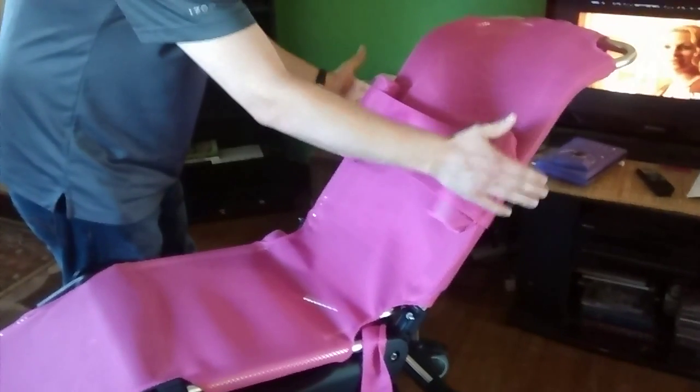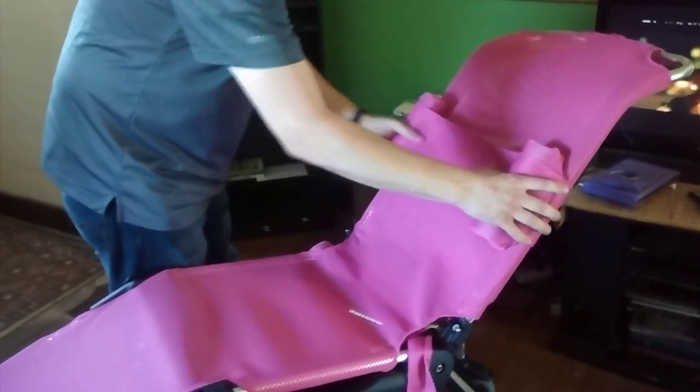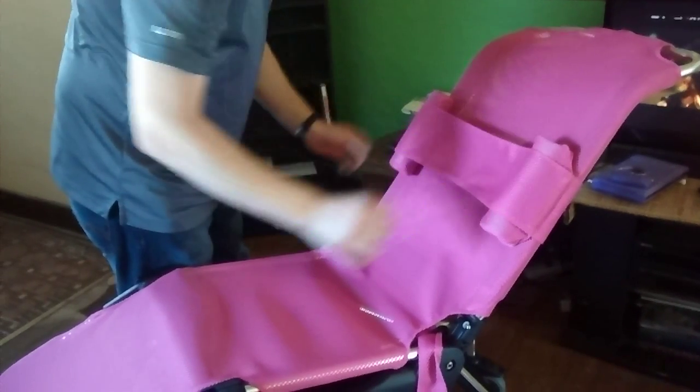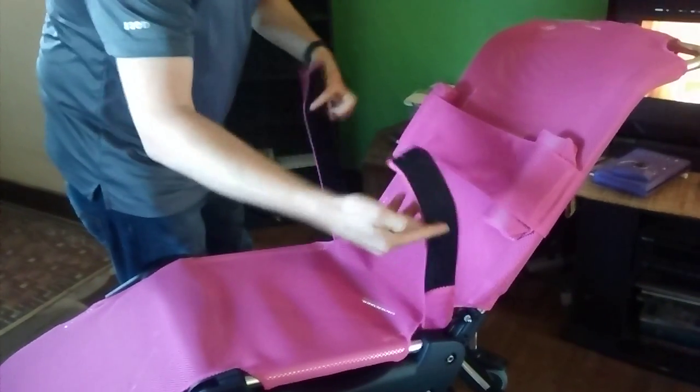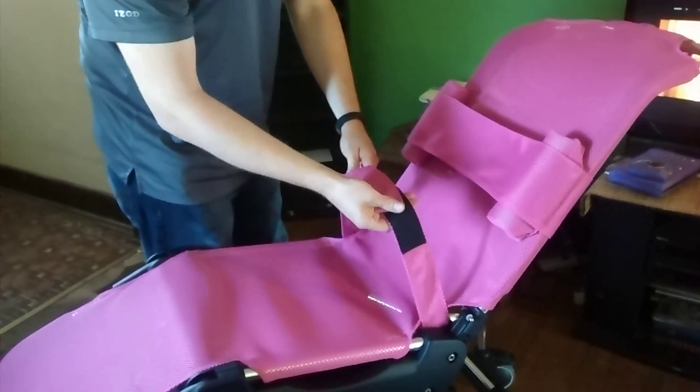We have our chest support here. It'll slide up and down to wherever she's comfortable. She just needs to settle in right between the two bolsters here, just to keep her centered in the chair. Once she's in, this seatbelt will velcro right around her to keep her in place.